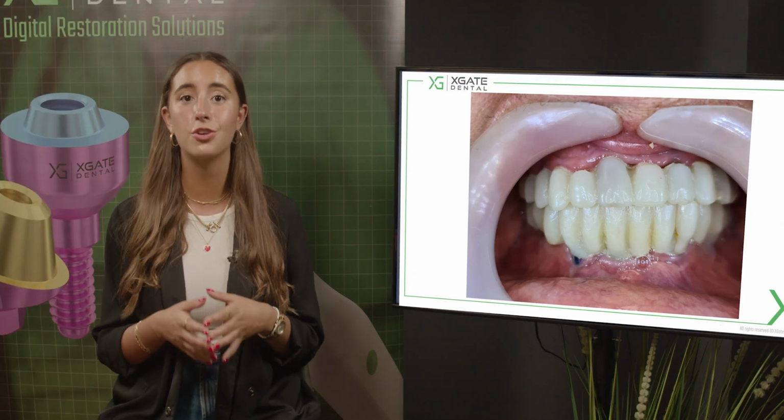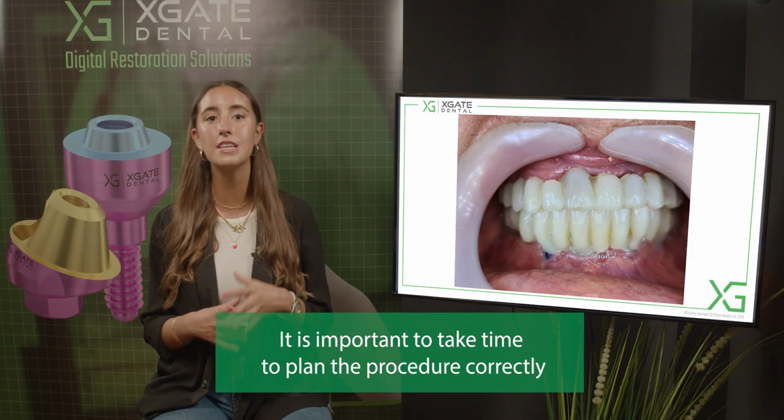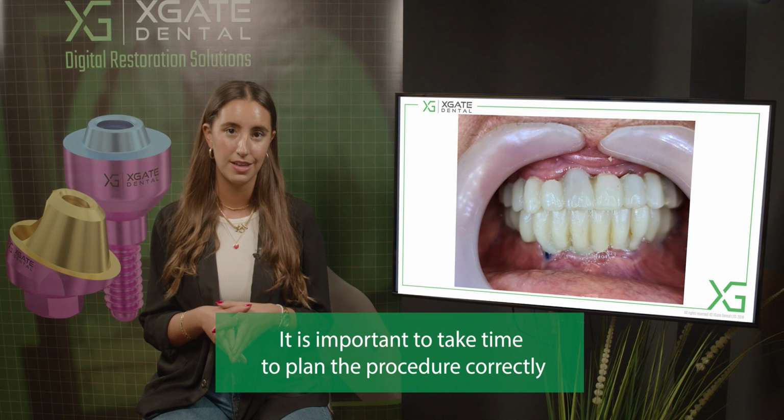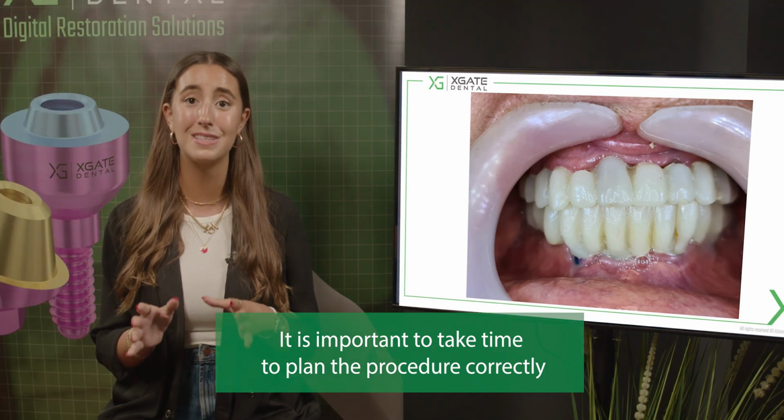The main point is that you're not doing it all in one visit. You need to take your time to make it perfect in order to get a perfect result in the end. This is still not a perfect result, but it's getting closer.